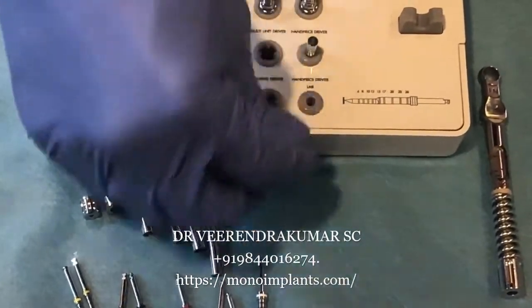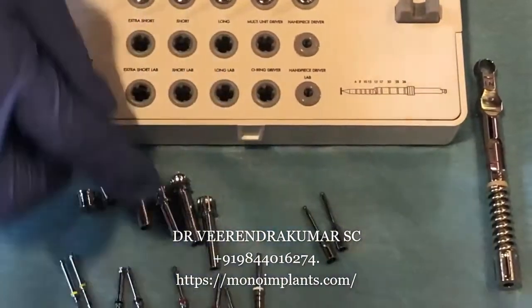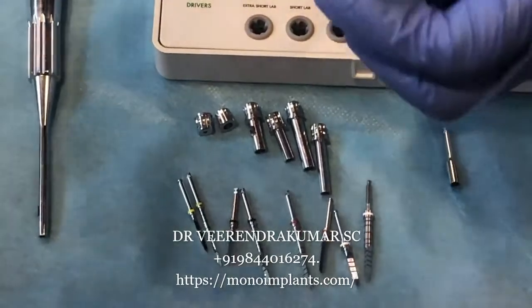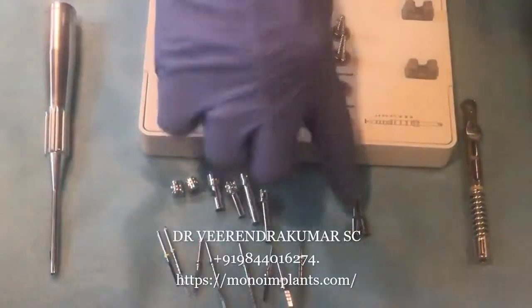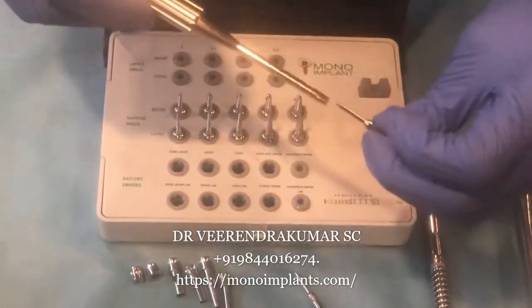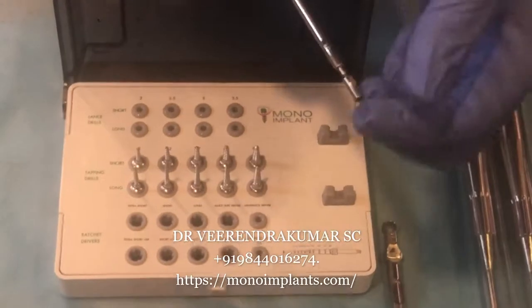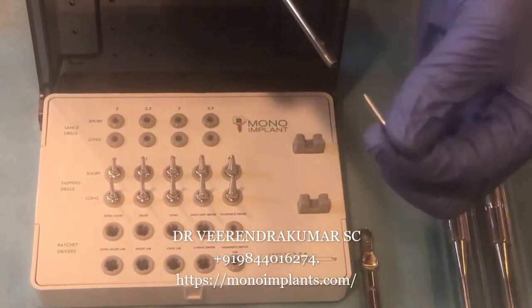You will also notice there are handpiece drivers. These handpiece drivers are useful — you can insert this into the handpiece, pick up the implant, and place it. This is also compatible with the hand driver we have. However, I suggest you do not drive the implant to the full length with this handpiece driver, because the hex will lock into it and the driver will not open up.